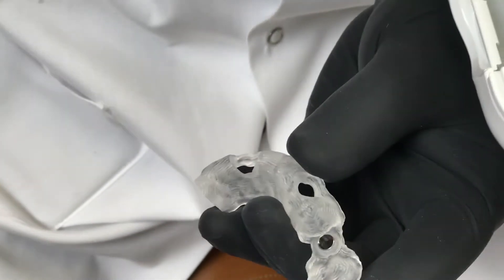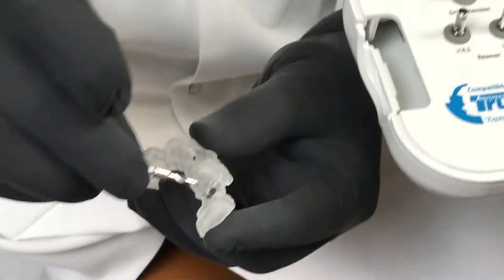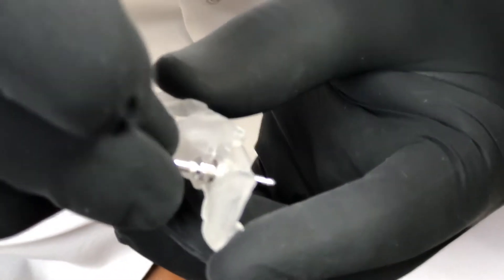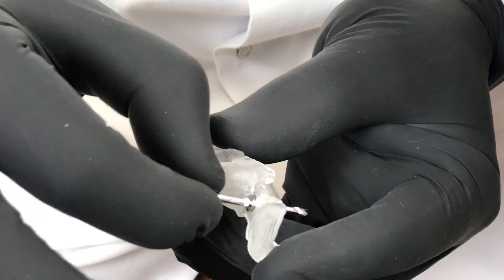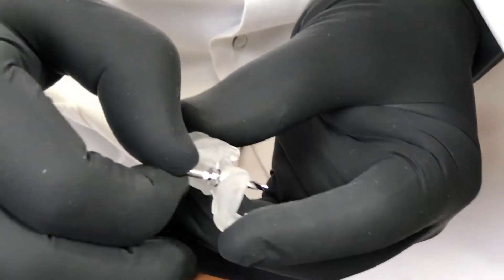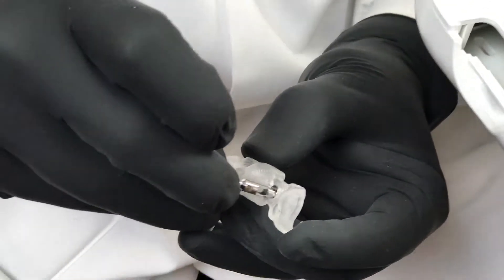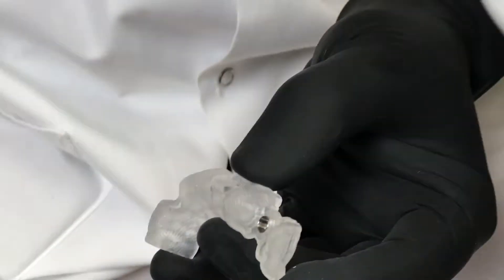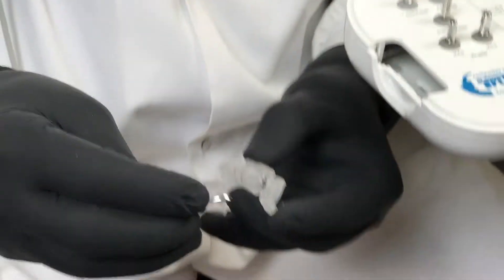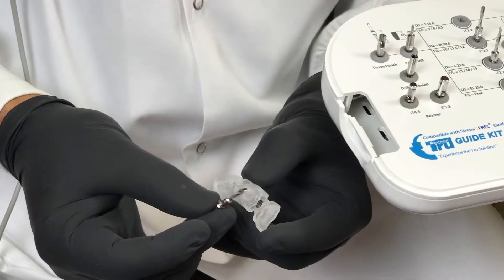What I really like is the fit of the drills. They go in very nicely with very little play. The punch hole fits very nicely into the sleeve as well. And this one is one of my favorite drills — this is the D218.